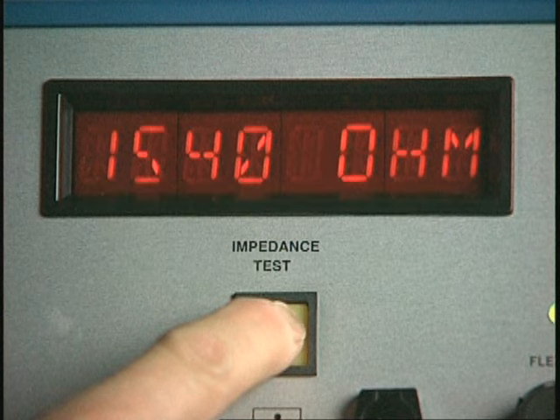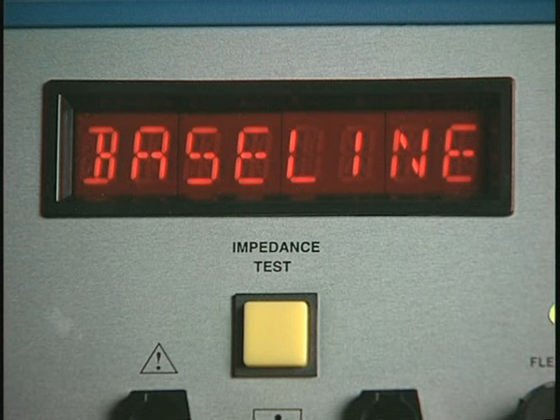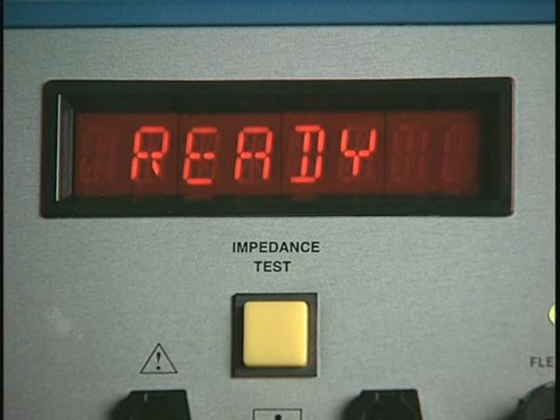The static impedance value in ohms will be displayed as long as the impedance test button is held down. When it is released, the word baseline will appear in the display for several seconds while a baseline EEG is collected. When baseline collection is complete, the ready message will appear indicating that the System 4 is ready to treat.